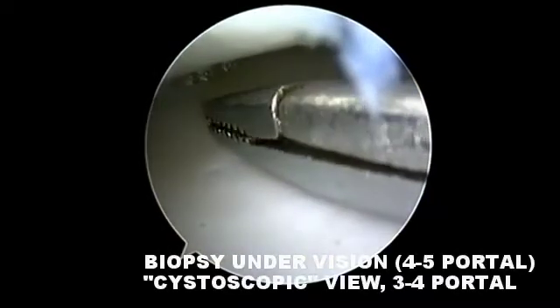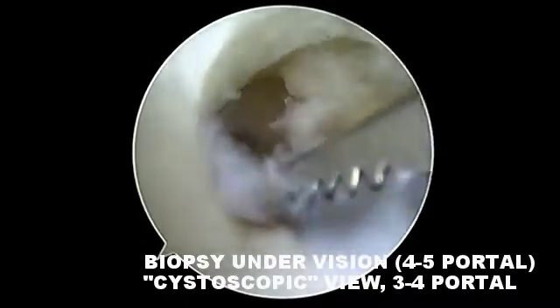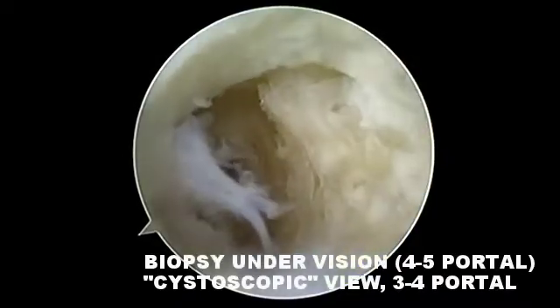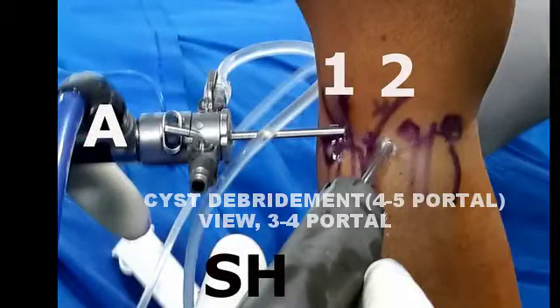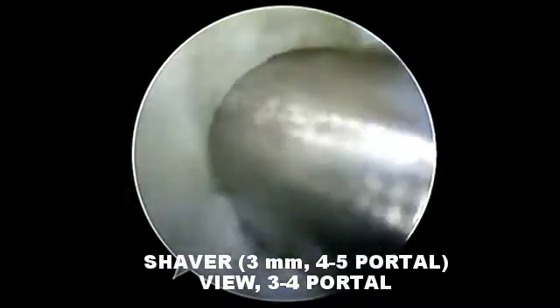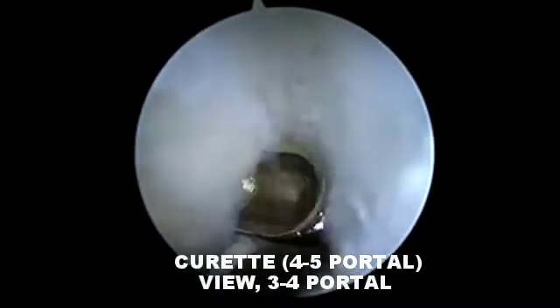A biopsy is obtained under direct visualization using a small joint grasper. The ganglion cyst is then debrided using a 3 mm shaver blade passed through the hole into the cavity. Additional curettage is performed using a small curette and an arthroscopic burr.